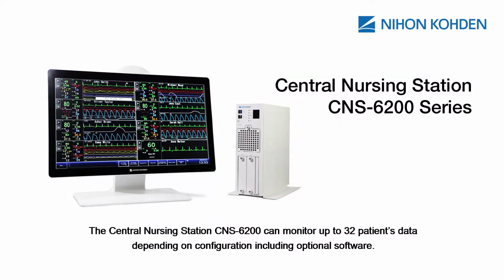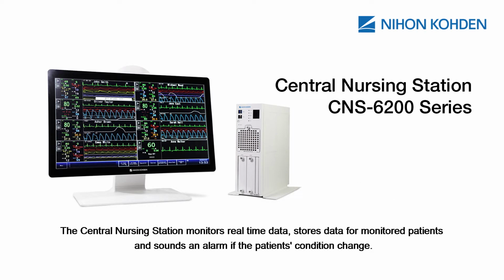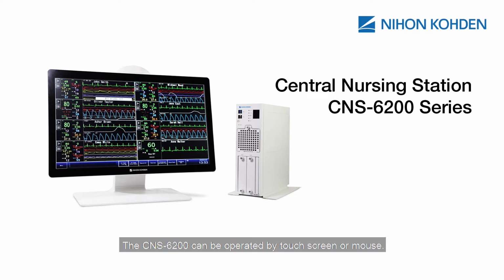The CNS 6200 can monitor up to 32 patients' data depending on configuration, including optional software. CNS 6200 monitors real-time data, stores data for monitored patients, and sounds an alarm if the patient's condition changes. The CNS 6200 can be operated by touchscreen or mouse.